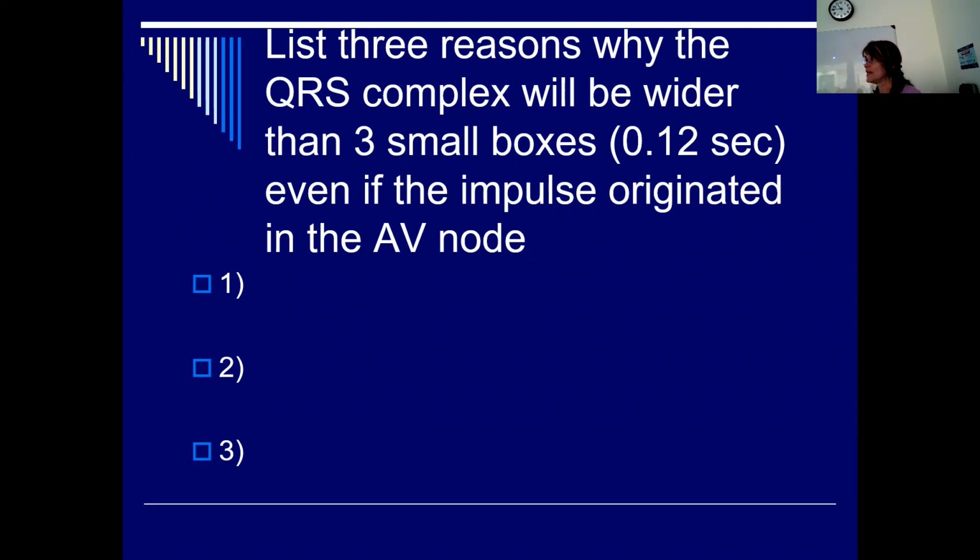And that's why the QRS looks different. If there's fibrotic tissue, it's going to take longer for the conduction to go through, and that's why the QRS is wider. Does that make sense? So dead muscle tissue, fibrotic muscle tissue, it just takes longer for the cardiac conduction to get through that type of muscle. And that's why the QRS will be wider.